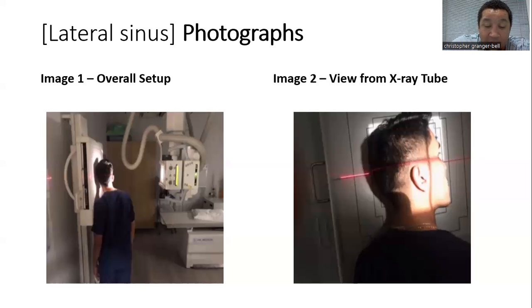Items in profile: orbital roofs, greater wings of the sphenoid, sella turcica, sphenoid sinus, frontal sinus, ethmoid sinus, maxillary sinus, rami of the mandible. The pathology best demonstrated was the air fluid levels in the sinus, fractures inside the sinus, and any lateral fractures of C1 and C2.